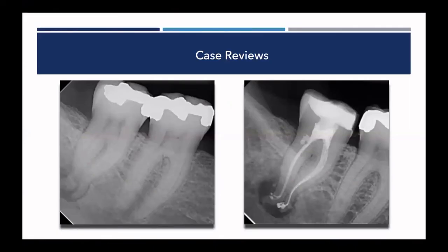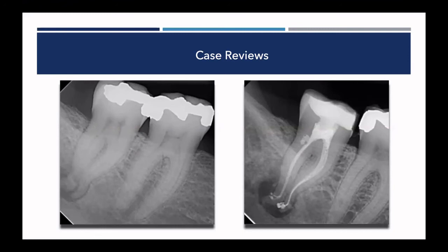Another complex anatomy case: multi-planar curvature with dilacerations and a large apical finding. On cases like this, I don't try to take my rotary file to full length — if you do that, you're asking for trouble. You instrument to an ideal working length, then use the laser — the laser is going to clean out the apical third of that tooth. Activate with the laser, let it do its thing, fill the case, and let it heal.